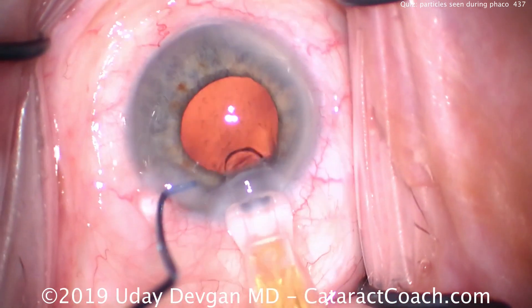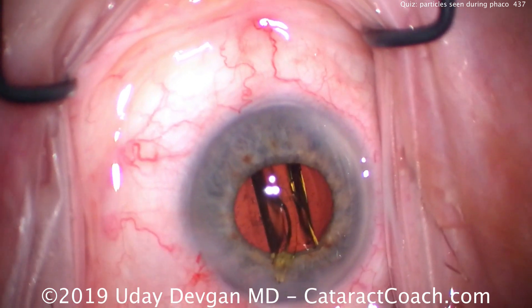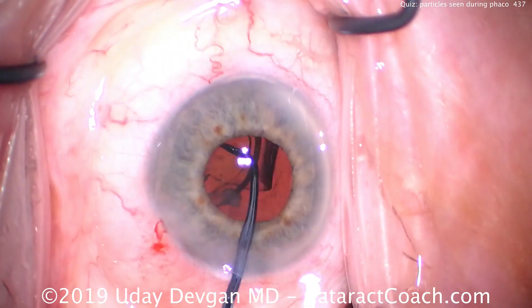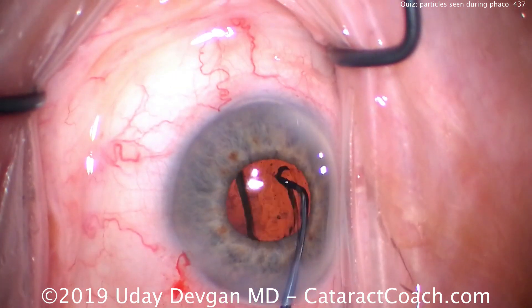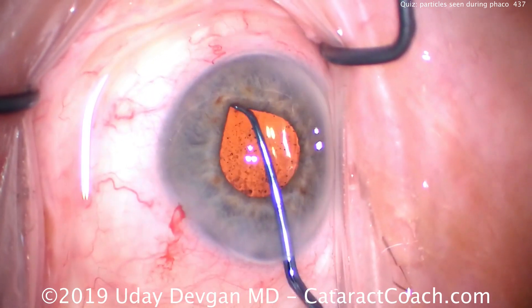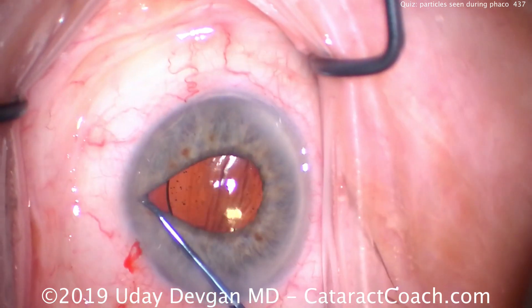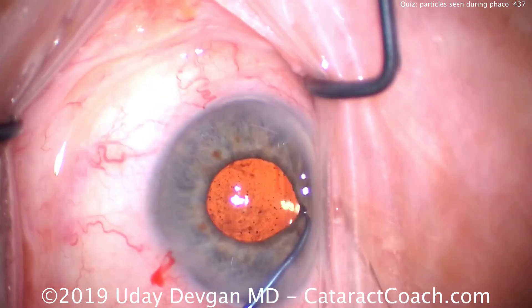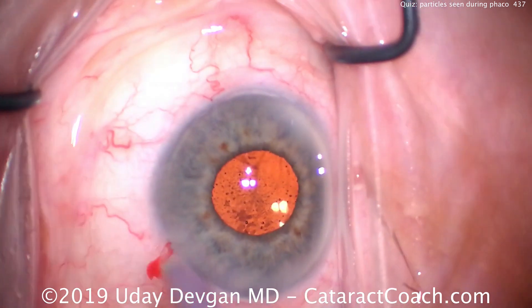Now here's the end of the case. The capsular bag is sort of filled with viscoelastic, and the IOL is going to go in the capsular bag. The phaco part went pretty routinely — we did a lot of chopping technique, broke up the cataract, emulsified it, and aspirated it down. As I put the lens in the eye, if you look here in the anterior vitreous, you see a lot of particulate matter. The posterior capsule is completely intact — there's no defect in the posterior capsule — but there is a defect at the zonules. We're going to look around and make sure there's no big chunks of cortex left, and it looks pretty clean in all quadrants. In this eye, we did put a capsular tension ring to help stabilize the capsule and to support the area that had missing zonules.